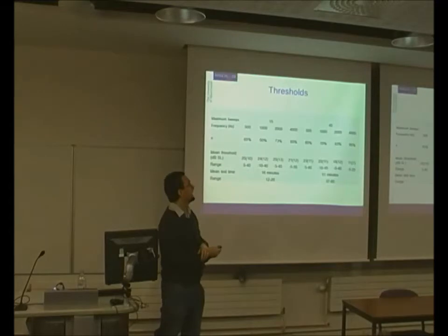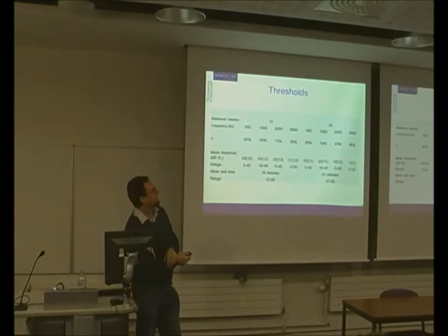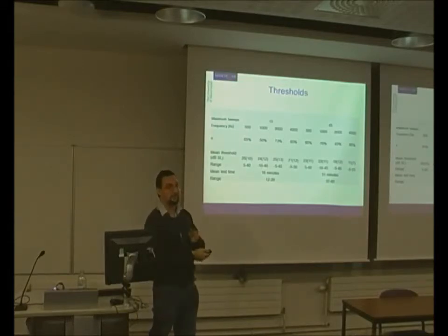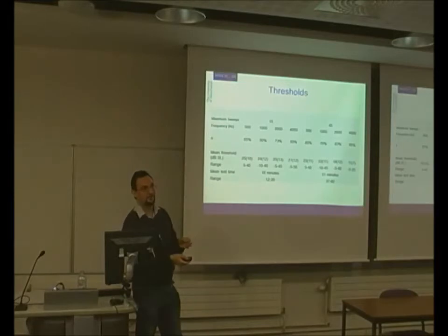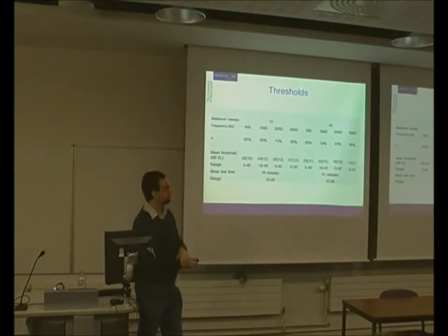So I suspect if we'd just gone up by 10 dB, we'd probably capture most of these people, but that's a best guess. And this is supported in the literature as well. There's other tables in different textbooks and CATs that show what the mean thresholds are, and there's quite a big standard deviation, so you expect quite a big range. But one thing that's key about all the literature is that no one really agrees on what protocols to use, what stimulus to use, and what recording times to use, so it's a bit variable.